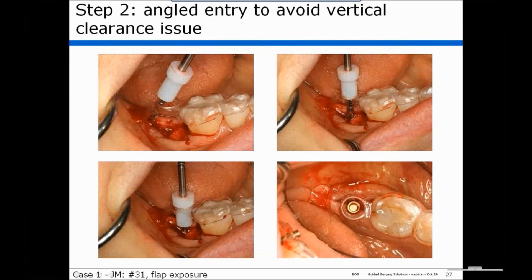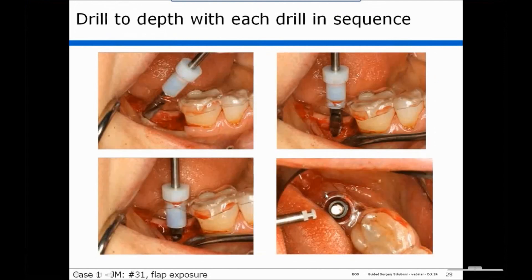Here you can see the drill is inserted at an angle, brought upright engaging the guide hole, and brought to depth. You can see how the depth stop engages the top of the guide to control depth. Looking at this view, you can see a surgical analog in place illustrating the position within the guide hole. We do this sequentially with each drill until you reach the desired diameter of your osteotomy, and here you can see the final drill in place in the center of the guide hole.